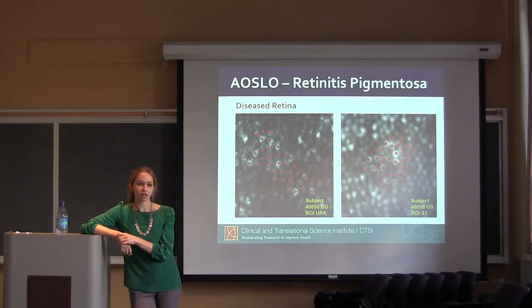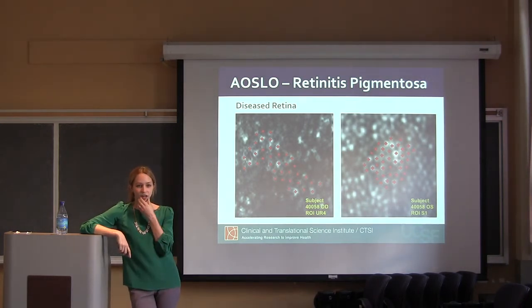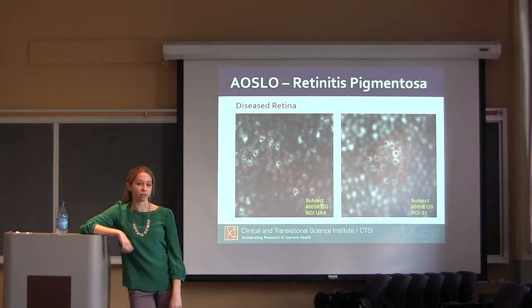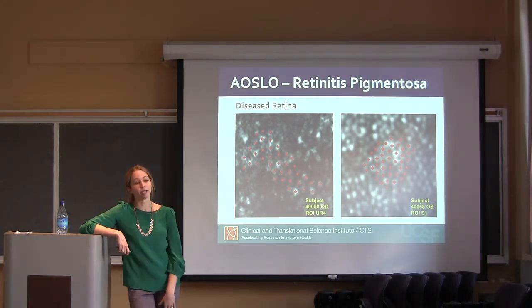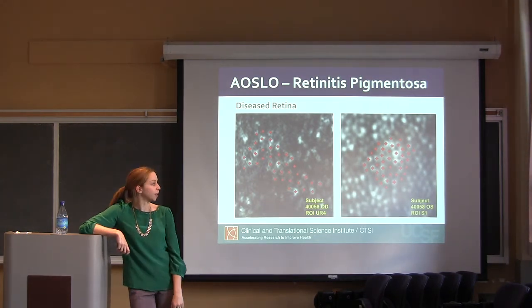Yeah, definitely. In my last talk, I listed all of the exclusion criteria, and that's exactly right. We excluded people that we thought ahead of time it would be very difficult to get good images on. And sometimes we would even bring people in for their baseline visit, and it was so difficult to get good images that we had to exclude them.